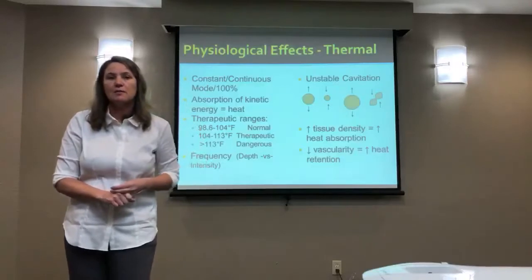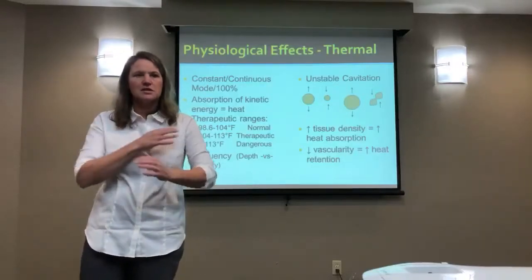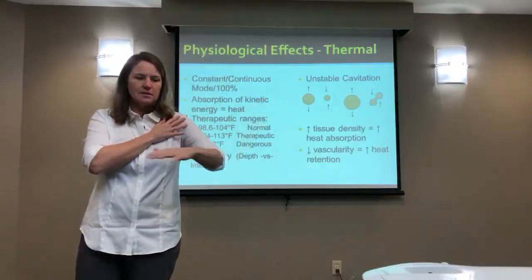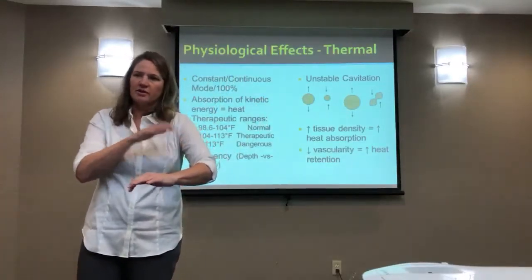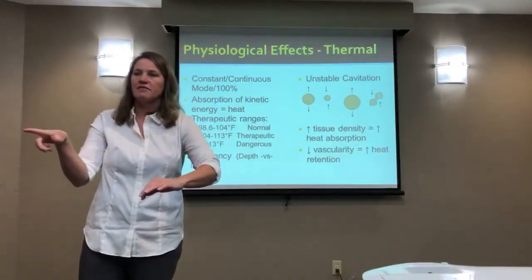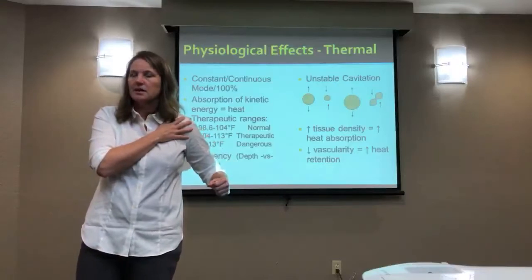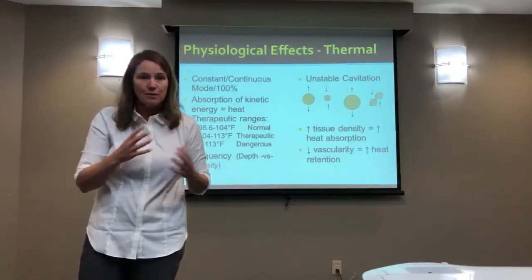And certainly think about the post time, because I've seen a mistake made where, let's say somebody had a tight shoulder, and you're trying to increase external rotation. Some of the mistakes I'll see is maybe that person's in a nice, comfortable position. The therapist is doing the ultrasound, they're having a nice little conversation while they're doing it. And then when the ultrasound time goes off, they clean their head up and they wipe all the gel off the patient, and then they proceed to do a stretch. If that's the method and your goal was to use that heating period, you've lost your best possible window.